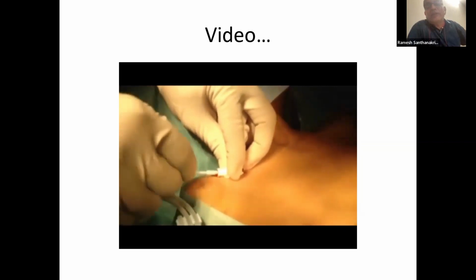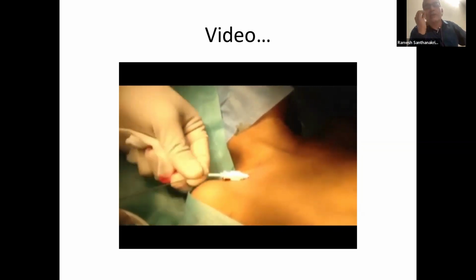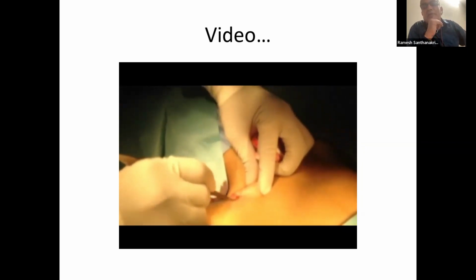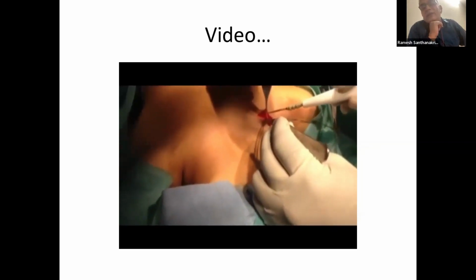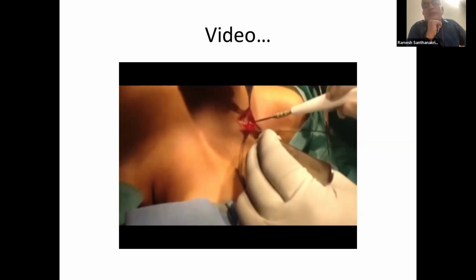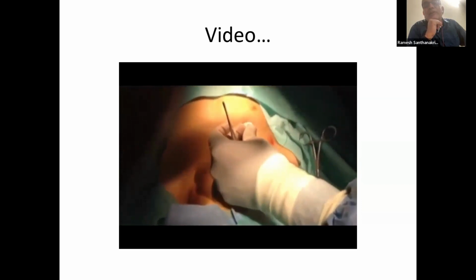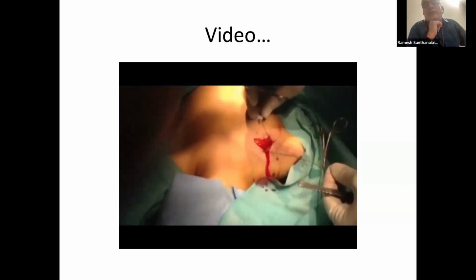Once it is done, the port is inserted, and we confirm it by means of a C-arm. The easiest clinical clue that we get that it is in the heart is when you see ectopic waves present. The moment we make sure that the needle or the guide wire is inside the central line or the desired position, we make a small incision to make sure that the entry is adequate. Then we insert the port, and definitely we make a good incision in the subcutaneous plane. You can put a finger inside to make sure that the pouch is adequately made without any tension.